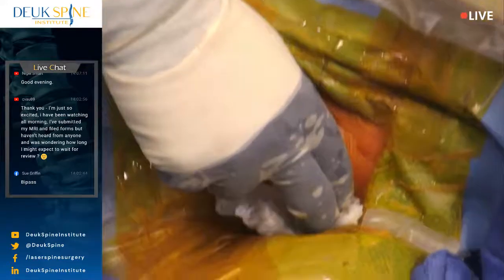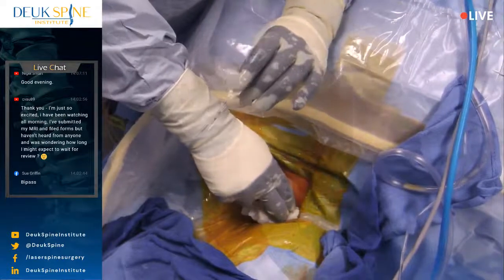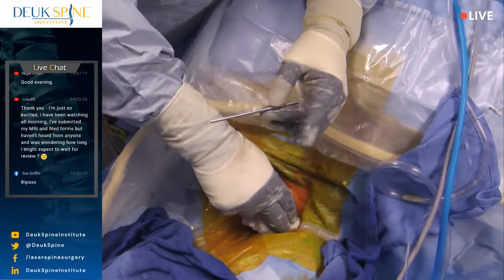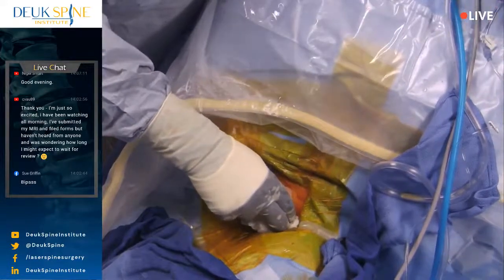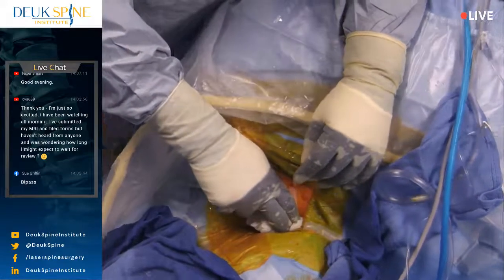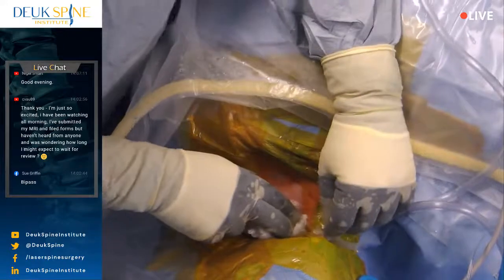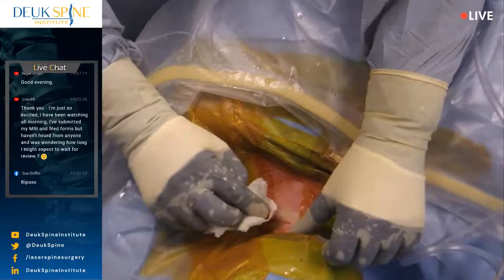See that? Why are my fingers looking black to you? Because I'm wearing a special glove that is full of lead. It basically reduces the amount of radiation from the x-ray machine that my fingers get, so I don't develop sarcomas or tumors on my fingers a couple of years from now, because I'm doing so much of the surgery. So they are radiation gloves, and they help protect my fingers from the radiation. But here, take a look. The whole surgery was done through a tiny little incision.